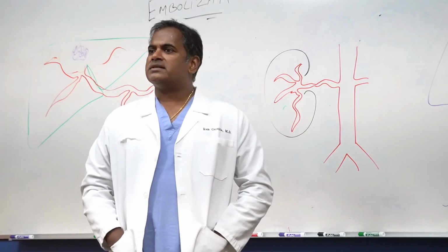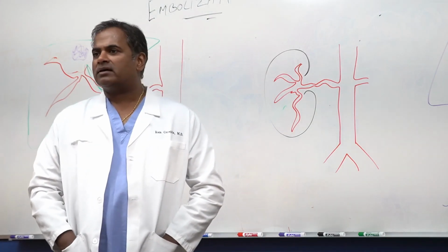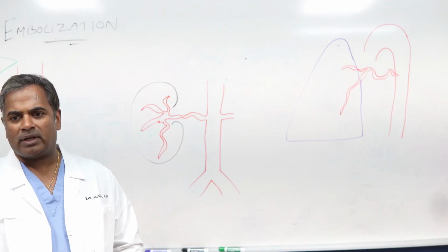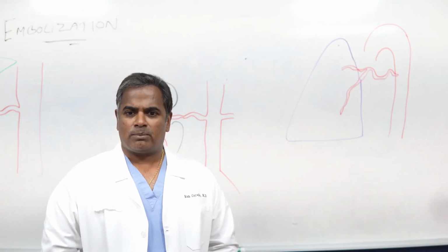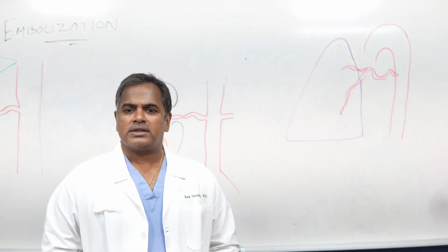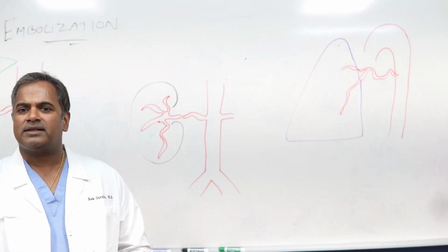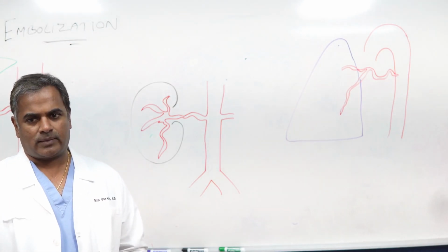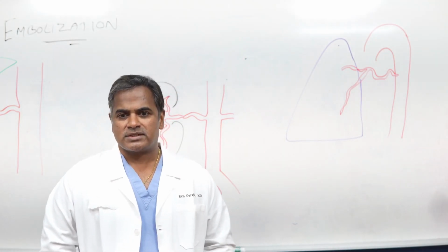The catheter is directed to the area to be treated, from where the embolization agents are deployed to seal off the blood vessels. When the embolization procedure is complete, the interventional radiologist removes the catheter and holds pressure or places a plug to stop bleeding. No stitches or large incisions are necessary for this procedure.